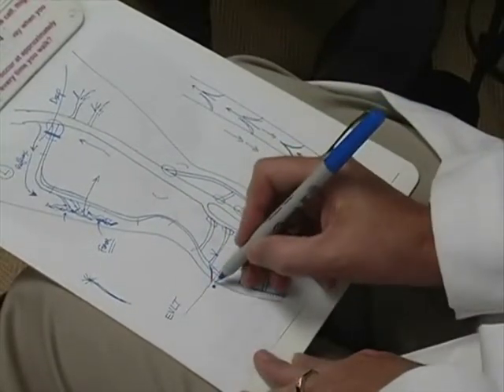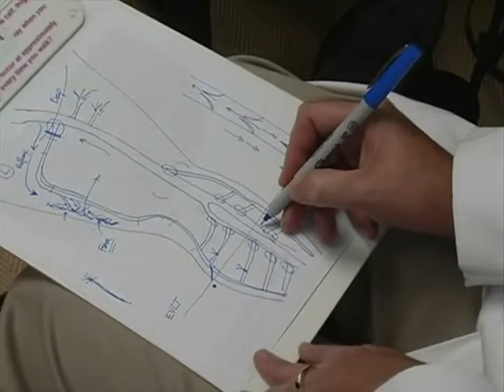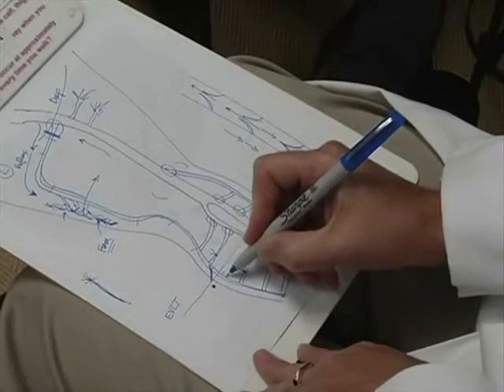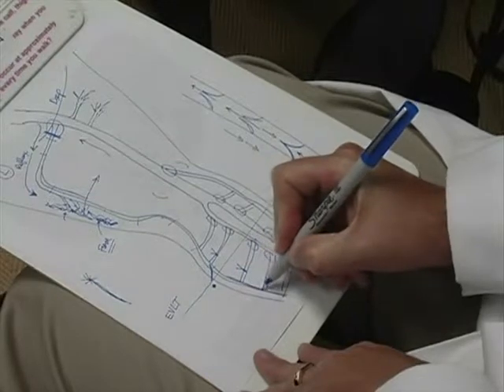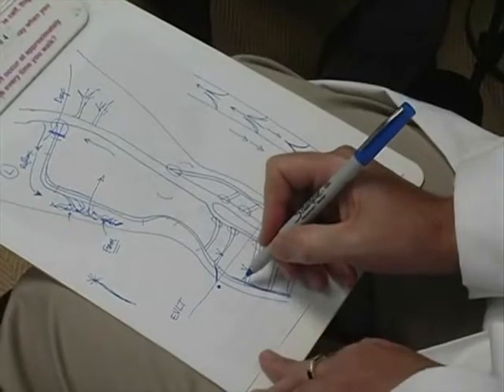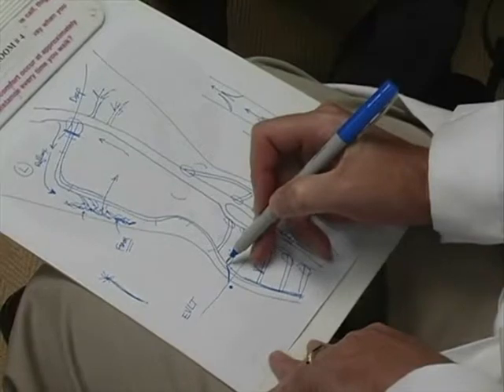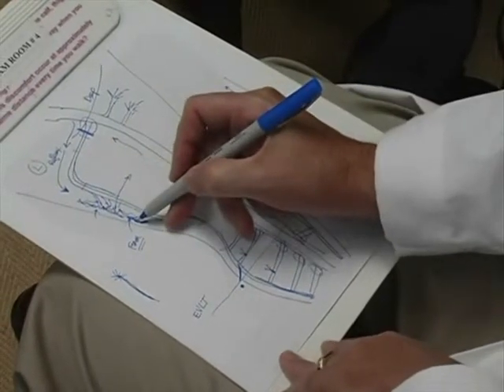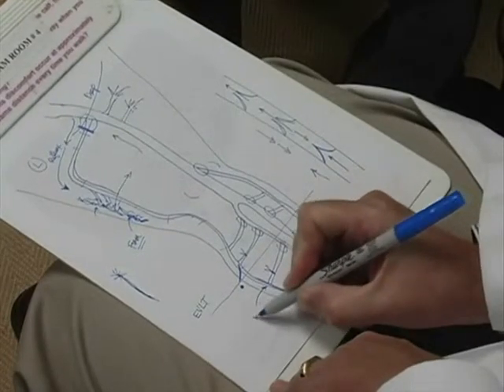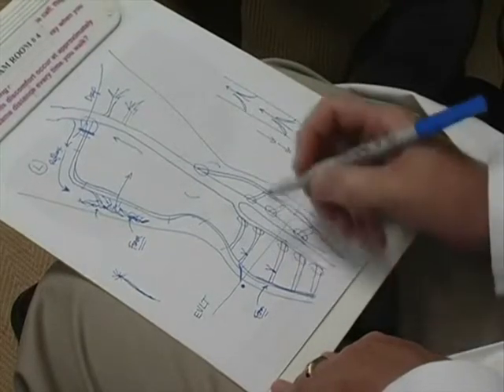Laser therapy cannot be completed below the mid-calf. The laser causes intense heat. There are very small nerves that come very close to the veins here. If you heat this vein, you will heat the nerves and cause nerve damage. But once you've taken the major pressure off, once you've closed these varicose veins, we can also use the foam, a chemical foam for varicose veins below this surface.